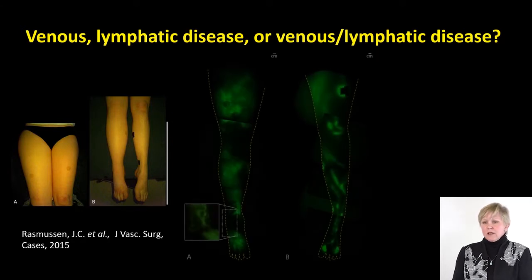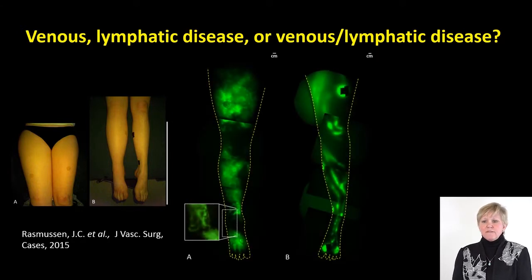It did not. And upon imaging, what we see is her affected leg has dermal backflow. Clearly, the lymphatics are involved. This is all compared to her normal leg, which has dilated lymphatic vessels, but clearly not the dermal backflow that we see in the contralateral leg.